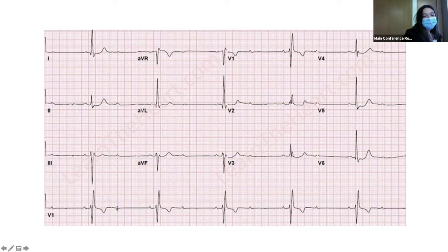Exactly. So this poor guy over here is alone without a QRS complex. Same with this one, and this one, and this one. So what about the intervals? What do we think about the PR interval? They look fixed, right? So what do we think this rhythm is?